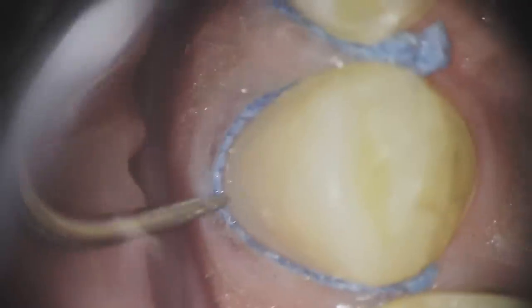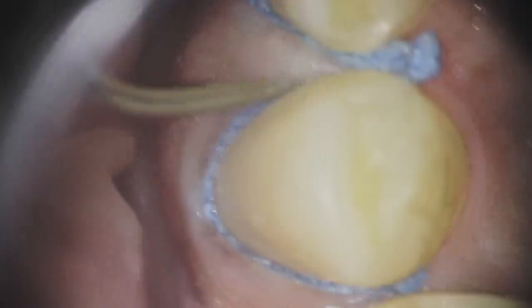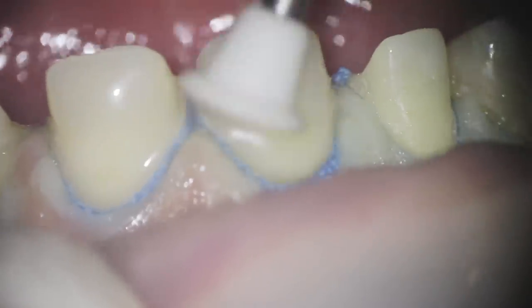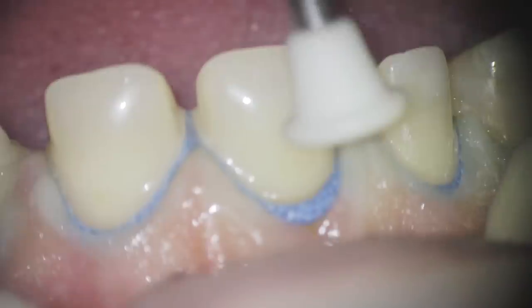After the first cord is in, you must inspect your retraction. If you cannot see more than 50% of your margin, you've chosen the wrong size — just take it out and put it in again. Don't be lazy, because even if you put the second cord in, you won't get that perfect impression. Trust me, I've been wrong so many times.